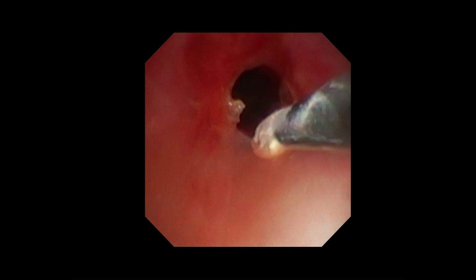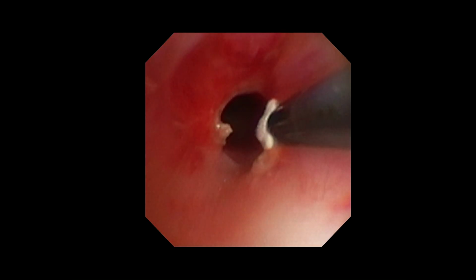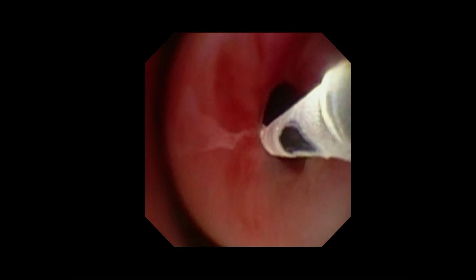And there is good amount of literature coming on the cryospray in such cases, but we only have contact cryo, so we use a 1.1 millimeter cryoprobe from ERBE through a thin scope, through the working channel of a thin scope, and then try to do the cryotherapy here, as you can see. Multiple freeze thaw cycles are being performed.